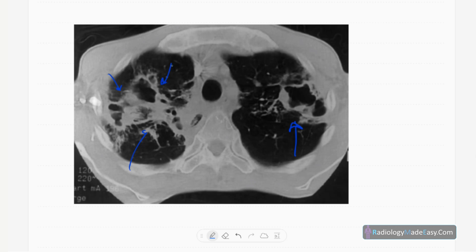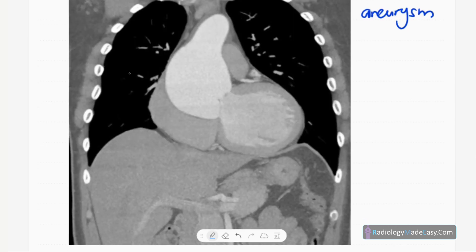On contrast-enhanced CT chest — essentially a CT aortogram — you can see an aneurysm in the ascending aorta: a fusiform aneurysm of the ascending aorta due to aortitis, which is seen in ankylosing spondylitis.